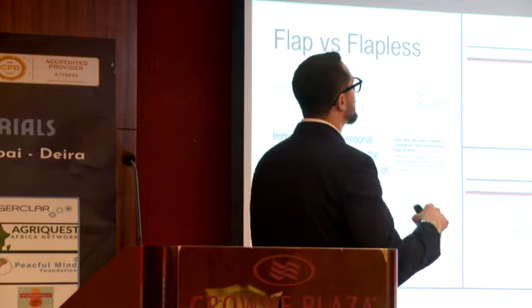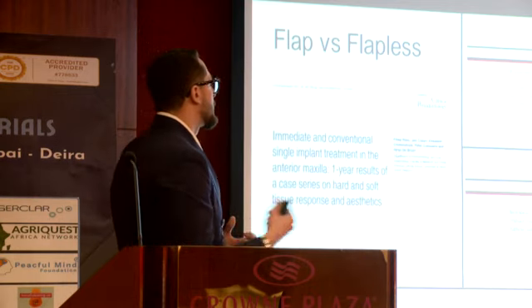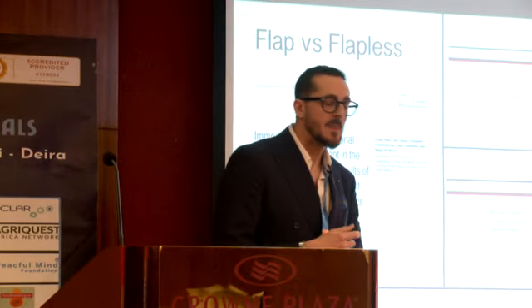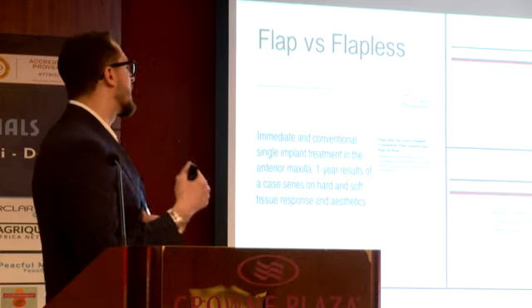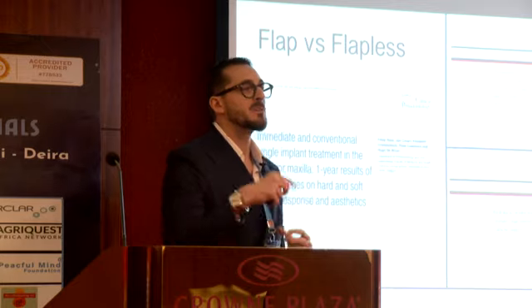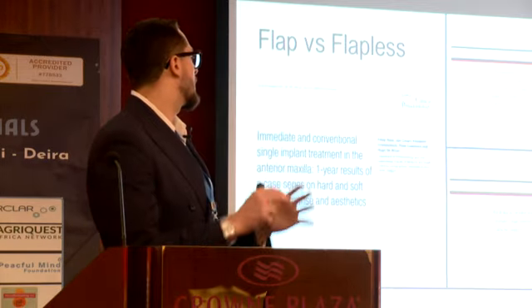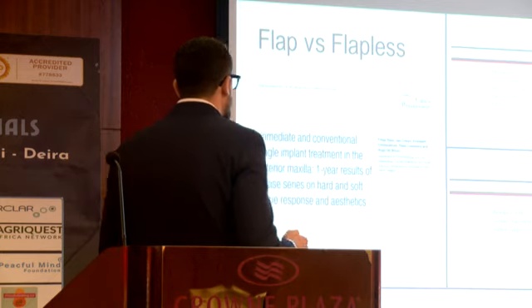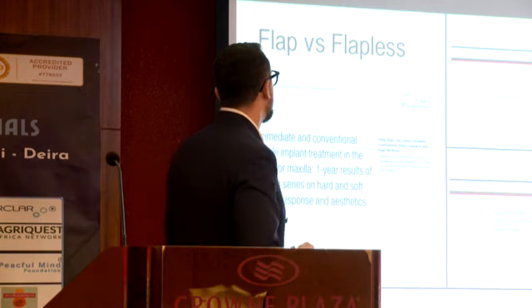Since I'm not cutting, not raising a flap, I'm reducing the inflammatory phase of the soft tissue, so I'm achieving less morbidity for the patient and the best quality of the immediate peri-implant soft tissues. That also means hard tissue stability since day zero of the procedure. So I will always go flapless if I don't need any kind of GBR.